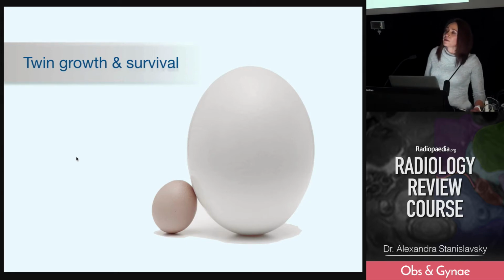And so what are we going to do to these babies? Well, we're going to do what their parents are going to be doing to them for the rest of their lives. And I say this with an authority of being a twin parent. We're going to compare them. We're going to compare them to each other as well as to all the other babies on a chart.